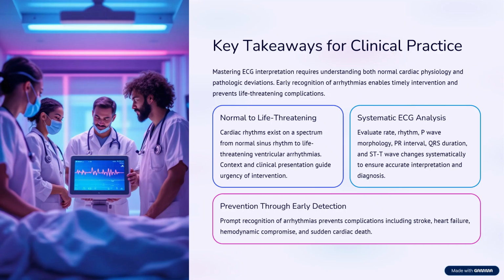Let's review the key points from today's lesson, focusing on what you need to know for assessment, monitoring, and timely intervention. First, understand the normal conduction system and sinus rhythm. This is your foundation. Know the normal parameters, practice reading ECG strips, and recognize when something deviates from normal. Second, assess the patient, not just the monitor.